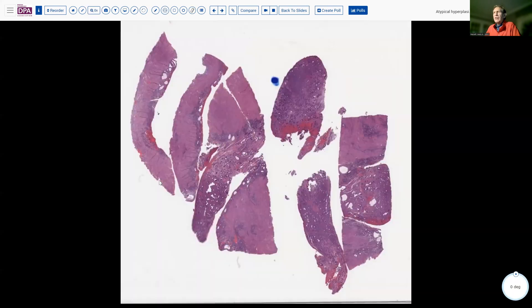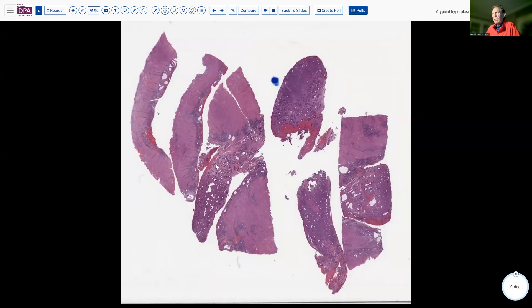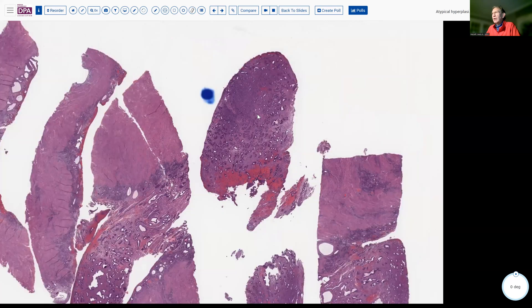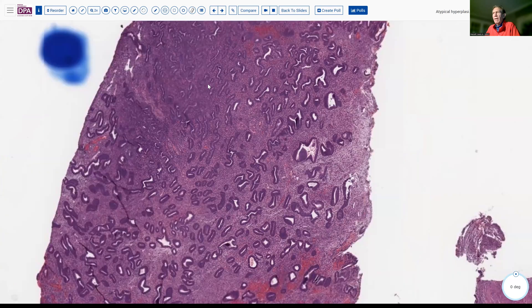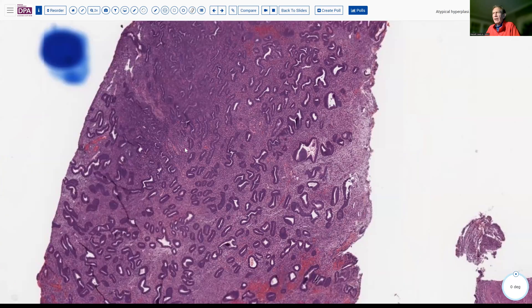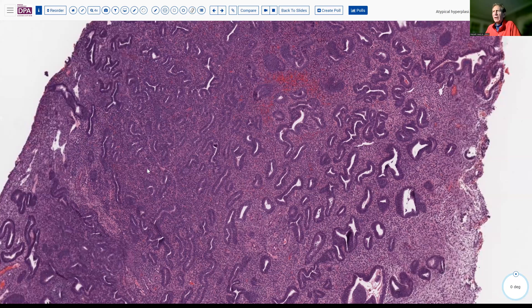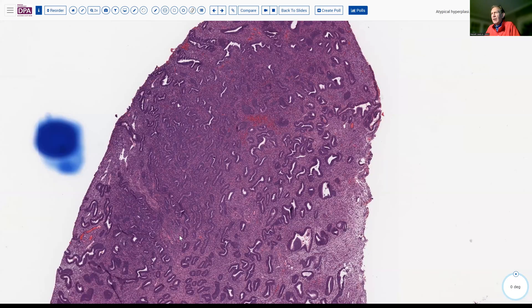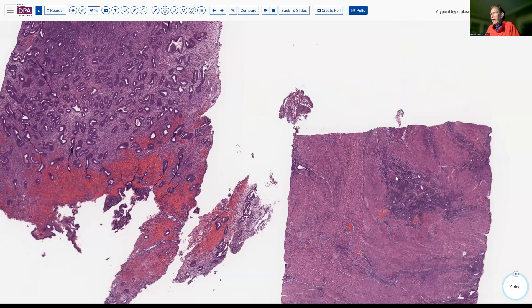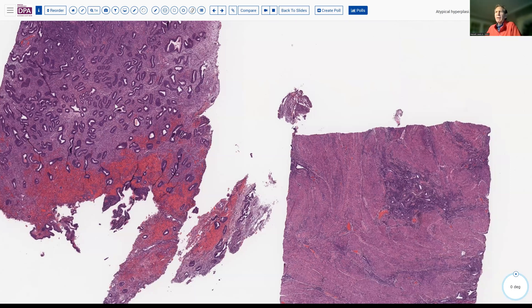So what happened with our patient? She came to our institution and got a hysterectomy. We examined the entire endometrium, and this was essentially the most abnormal area — a little bit of a polypoid change with a little bit of glandular crowding. It's a little dark because it's somewhat thickly sectioned. In this area we do come to the point where we have probably greater than 50% glands. However, the cytology between this area and the adjacent more baseline endometrium was not particularly different cytologically — so just architectural abnormalities. I don't think this would meet most people's criteria for EIN based on the cytology not being significantly different.